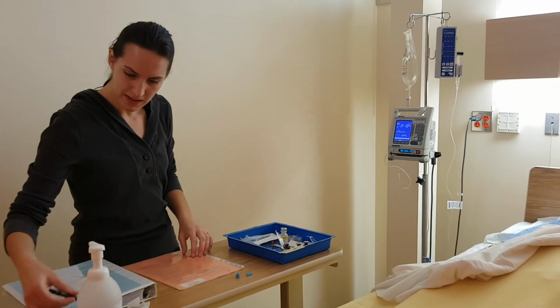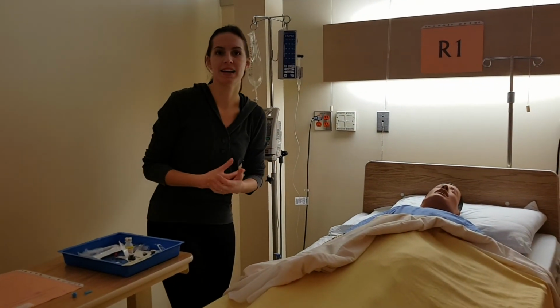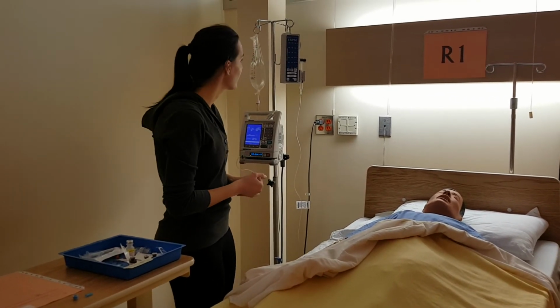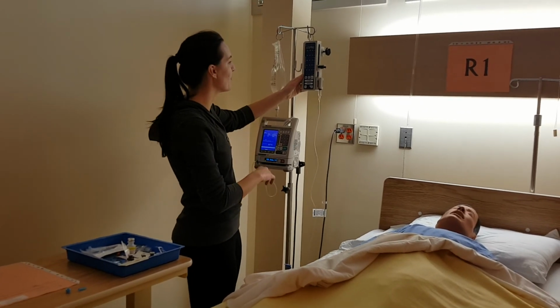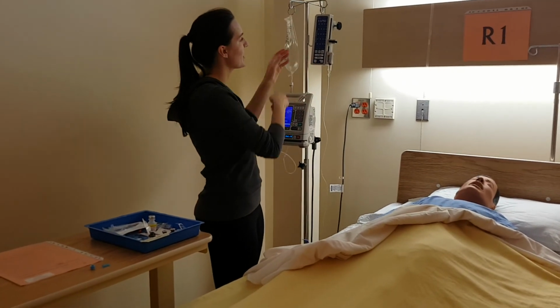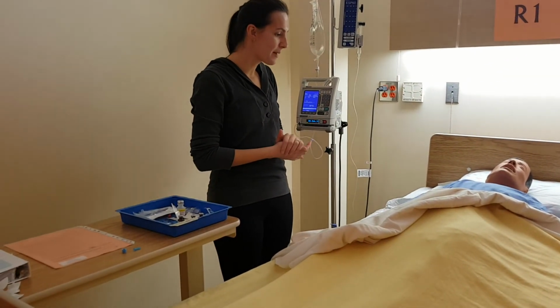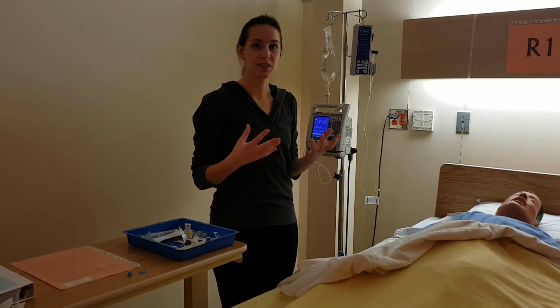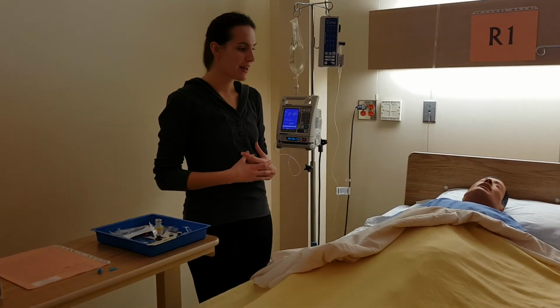Okay. And I'm going to stay with my patient just to observe for any immediate signs of allergic reaction, or any signs or symptoms that the medication is not going very well for them, and just to ensure that the plunger is being depressed. And I'm going to continue to monitor my patient for adverse effects, and as I've let them know before, I could remind them of those adverse effects, and if they do experience any of them, to let me know.